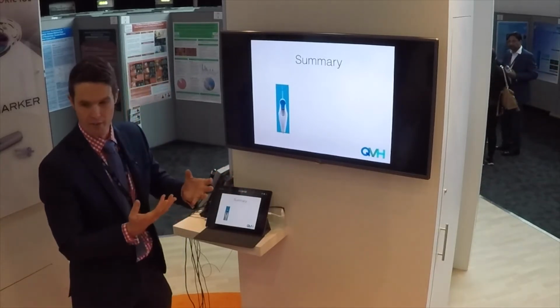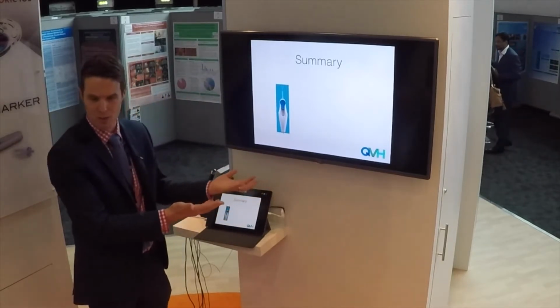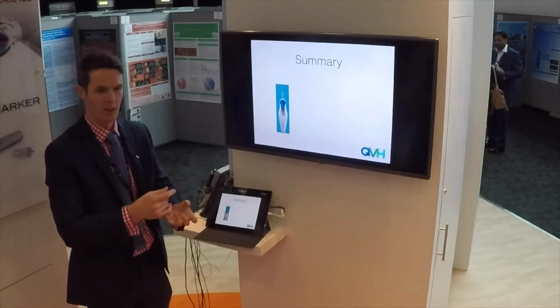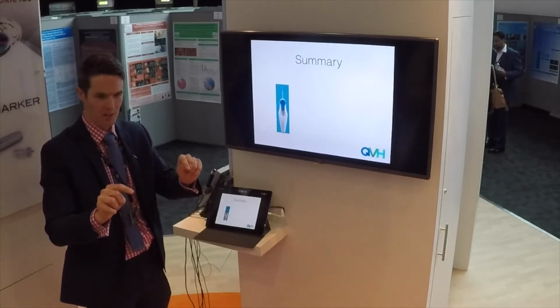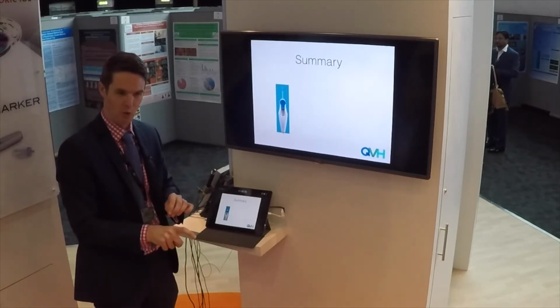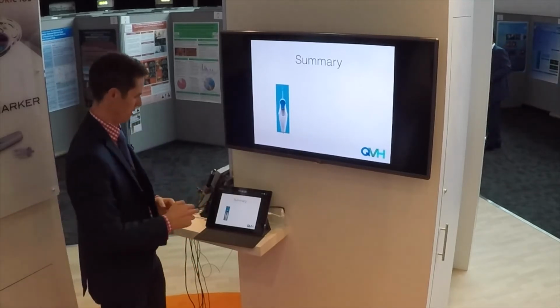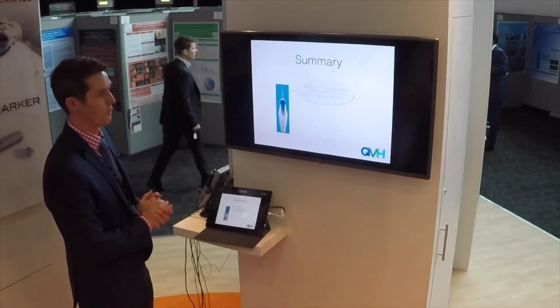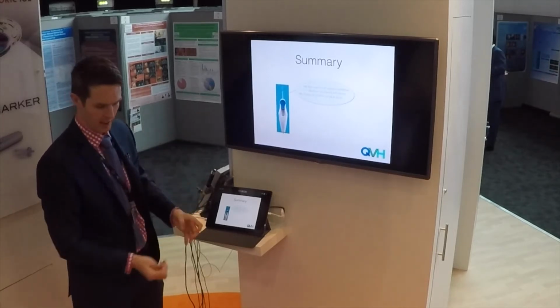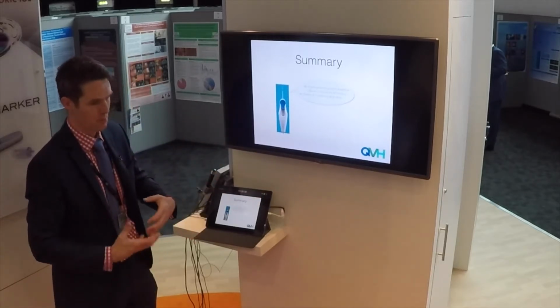So the arguments for femto are that it's useful for juniors to learn, instead of having to use a manual capsulorhexis. But I would say that this is easier than that, because having done femto, you've got to learn how to dock, you've got to then have somebody plan on the OCT, and then do the treatment. With this, they're using something that they're already used to, which is the microscope and their hand-eye coordination. Above and beyond that, it's pretty simple to do. And there's no interruption of workflow. It doesn't require big kit. It doesn't require atmospheric changes. It can all be done at your cataract station. You don't need to go over to the femto and then bring them over to the operating table, so it's much easier.